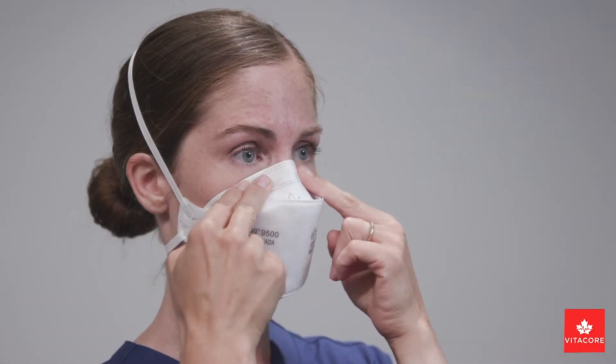If air is leaking from the sides of the mask, make sure that the top strap is placed high on your head. The respirator should fit snugly against the face. Repeat the user seal check until you are assured of a proper fit.